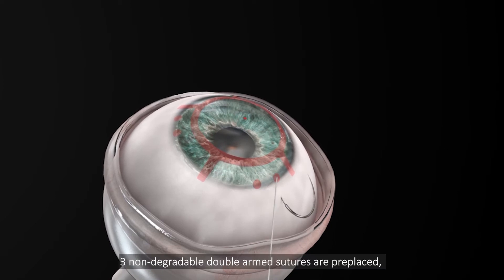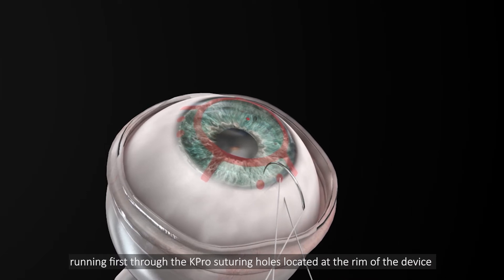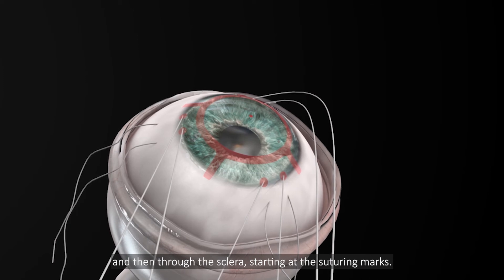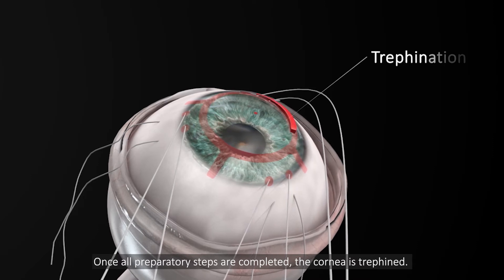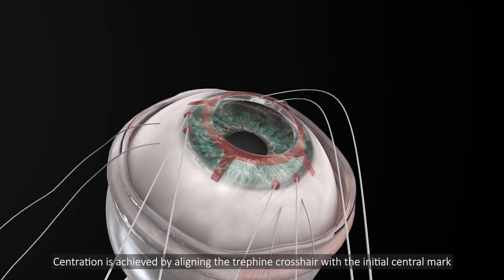Three non-degradable double-armed sutures are pre-placed, running first through the K-Pro suturing holes located at the rim of the device, and then through the sclera, starting at the suturing marks. Once all preparatory steps are completed, the cornea is trefined. Centration is achieved by aligning the trefined crosshair with the initial central mark.